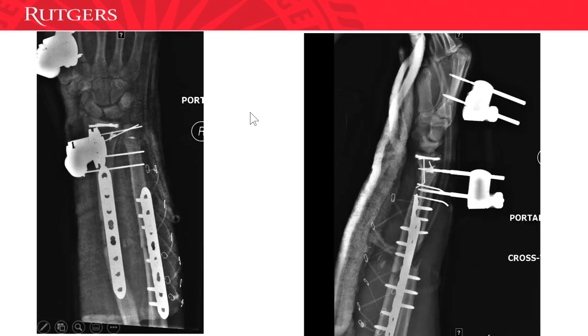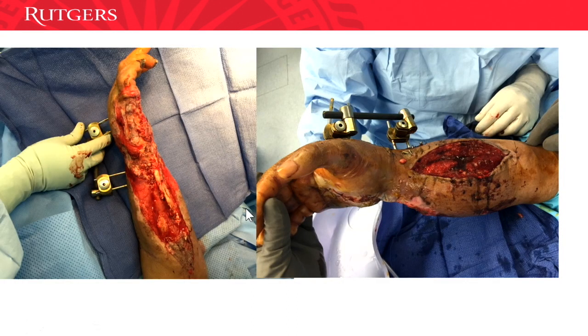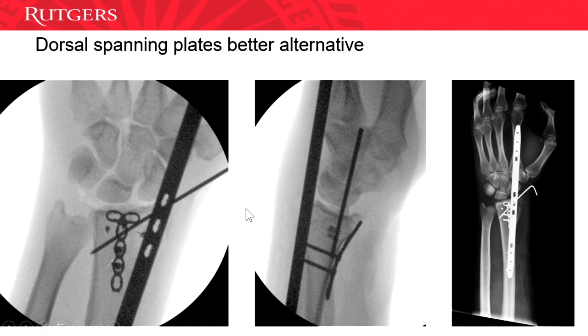This is where an X-fix was placed distally, just proximal to Lister's to span this. And that was done because this patient could not get plates at that time. I think a dorsal spanning plate, if I can, I'm much more likely to put that on than an external fixator because the patient doesn't have pins sticking out. They can bear weight on it right away.